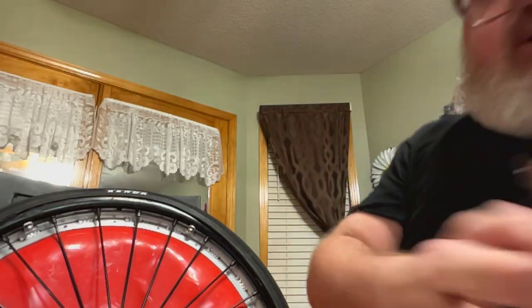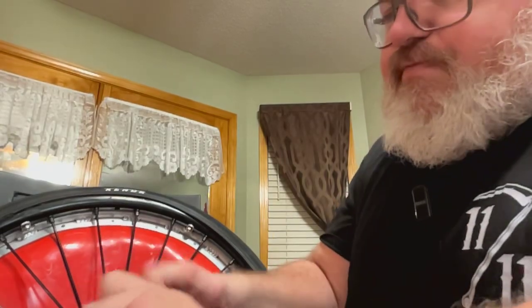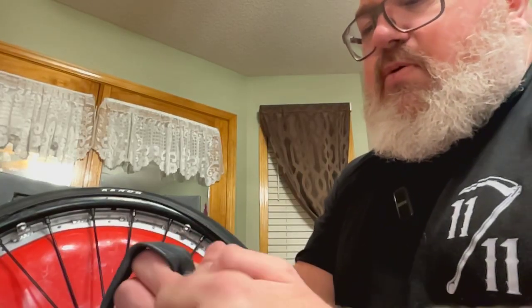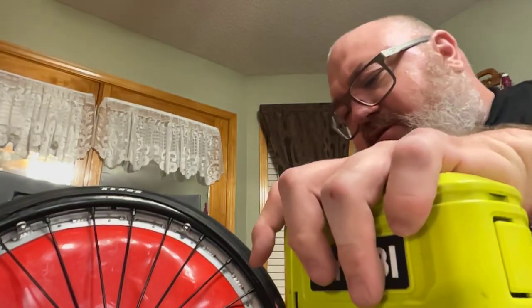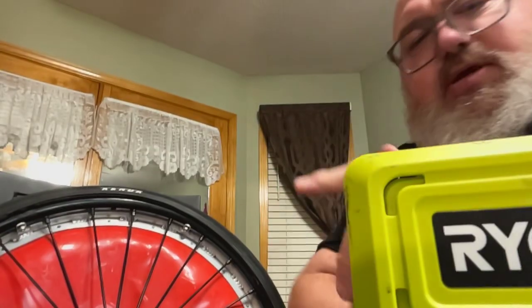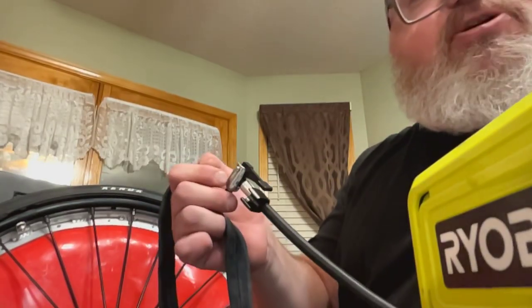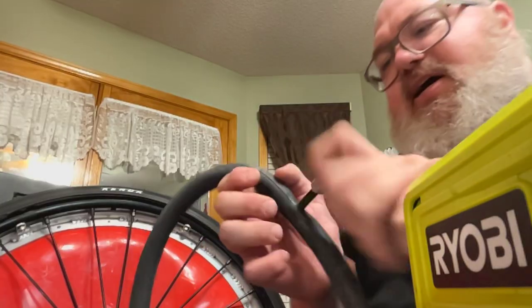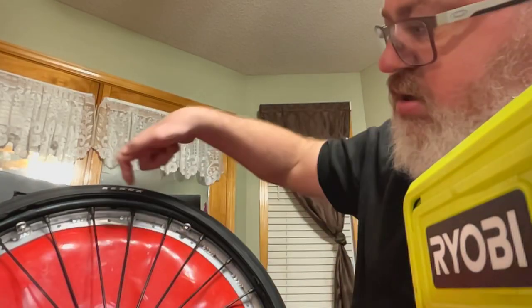Yesterday's video, I talked about putting just a little bit of air in the tube, so the tube comes flat. They have these little black things on them. I think they're called valve caps or something like that. I don't know what they're called. I throw them away. They don't really do anything good. Supposedly they keep air in. I've never really used it. So, as I said yesterday during my video, I usually put a couple PSI just to give it some shape. I'll plug that, and then I look for my arrow, which is right there.